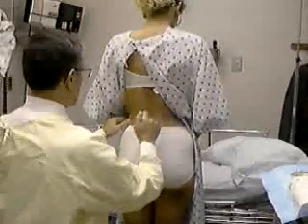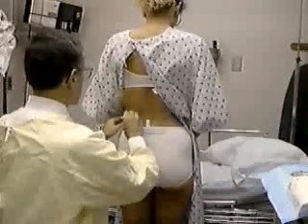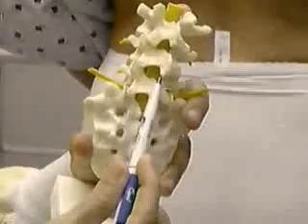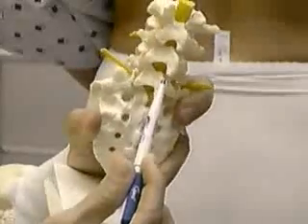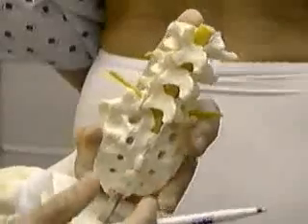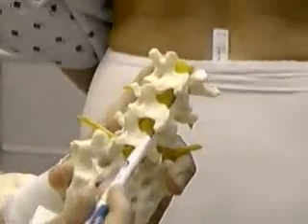The level of the superior iliac crest corresponds to the interspace between the fourth and fifth lumbar vertebrae in most adults. Mark the level of the superior aspects of both iliac crests. The spinous processes of the vertebrae project out from the backbone. You must slip your spinal needle between these projections. Flexing the back forward opens up a space through which the needle can pass.